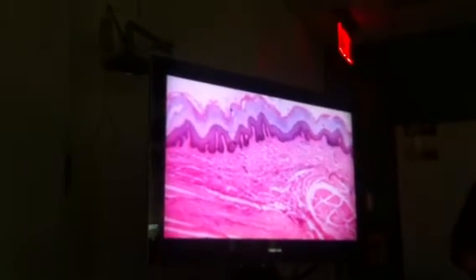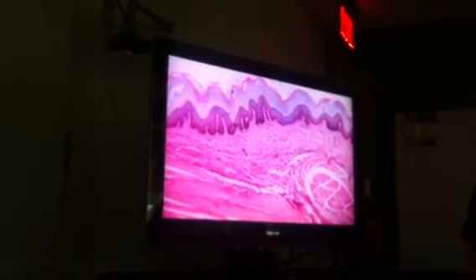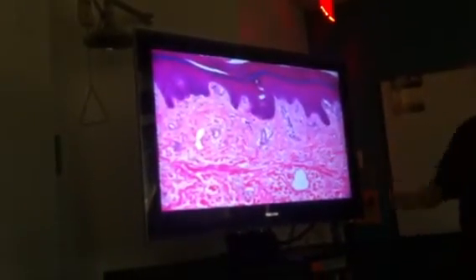These are not little round things. If you look at your fingerprints, they are caused by these papillae in the dermis, and they're not just little round things. They're long ridges that kind of move around. Here's one that has a very nice stratum lucidum that you can see stained in different colors, so it really comes out. We have the epithelium, we have the papillary dermis, and then we have the reticular dermis below that.